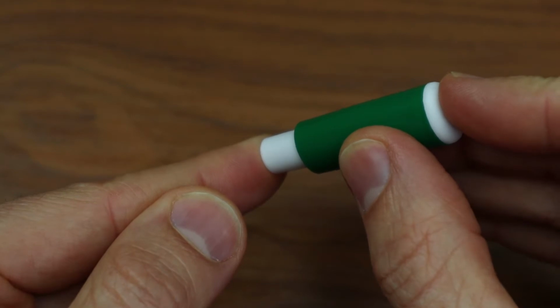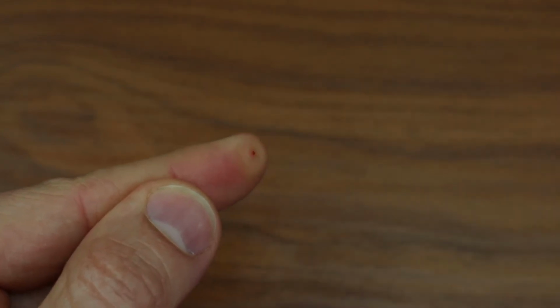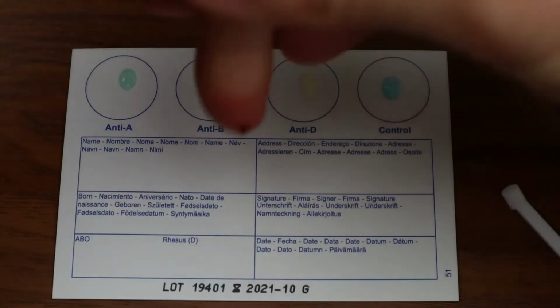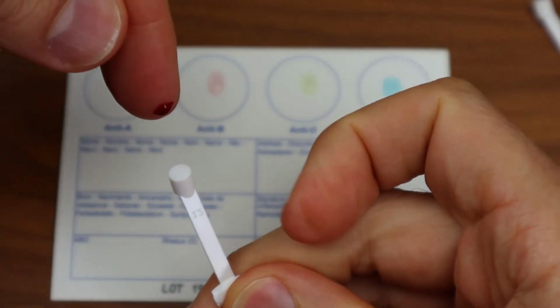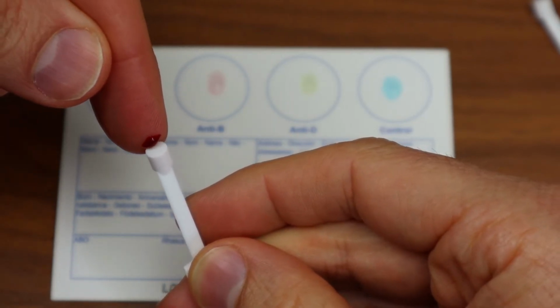Now push the lancet firmly against the skin of the finger you just cleaned and go to your happy place because it might sting a bit. There, not too bad. To get the blood flowing, you might have to massage your finger in a squeezing motion. There we go. Once an ample drop of blood becomes available, transfer it to the tip of one of the Eldon sticks.